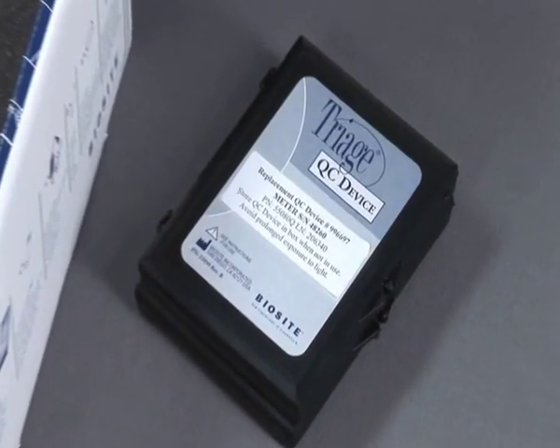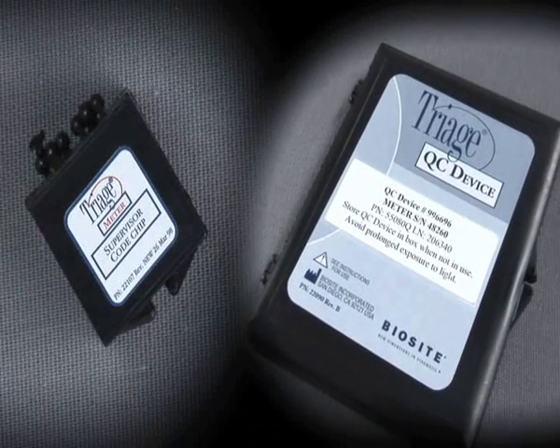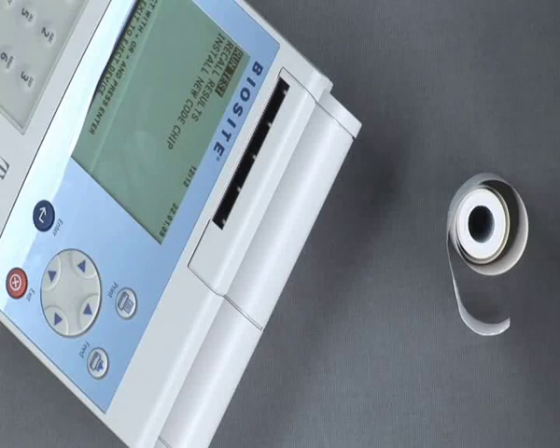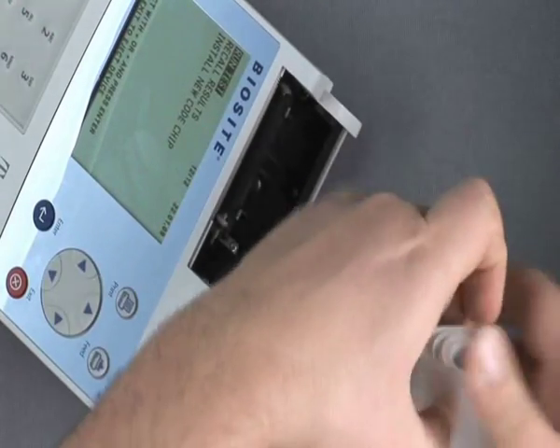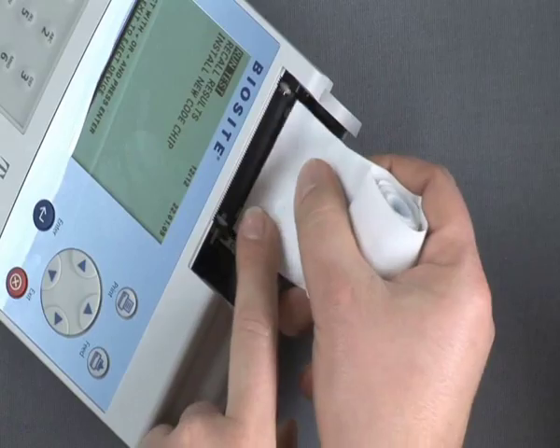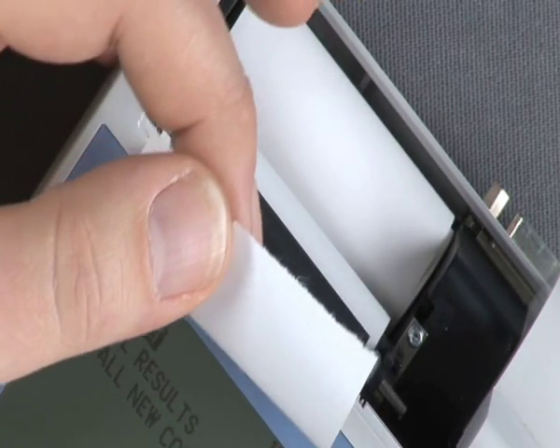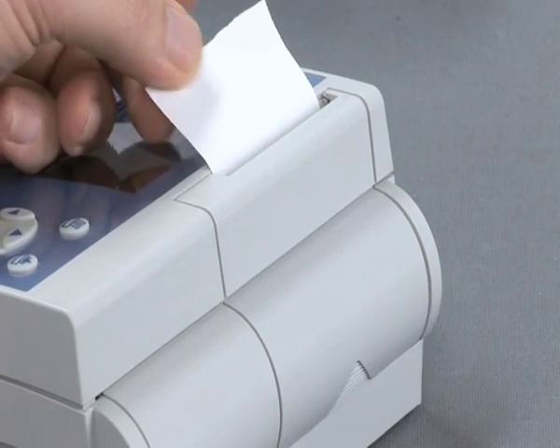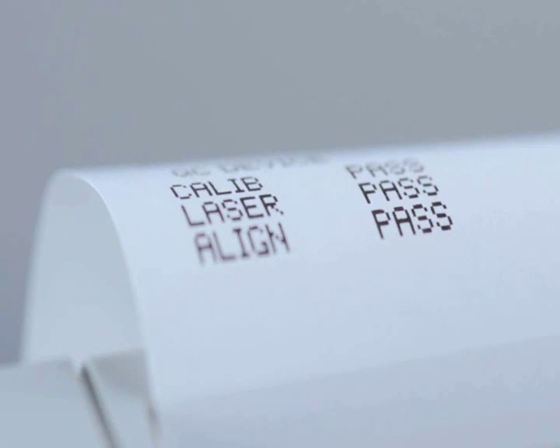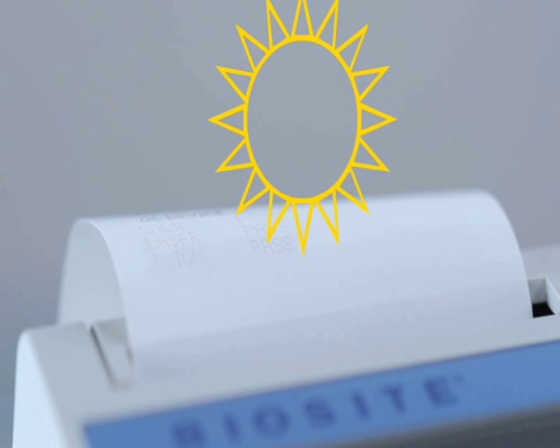QC device. Supervisor code chip. These will be explained later during this program. Paper rolls. Open the lid and add the roll to the printer as shown here. Use the paper feed button to complete the installation. As this is thermopaper, we can only use one side. Keep the printout away from direct sunlight as the printing will fade away.